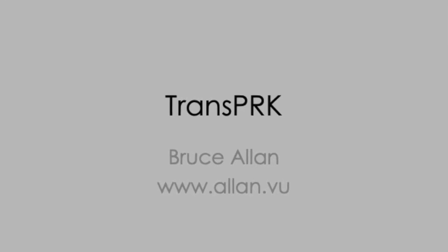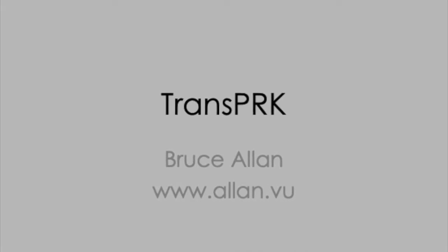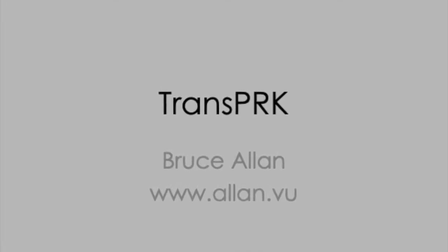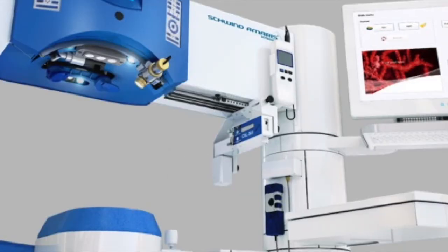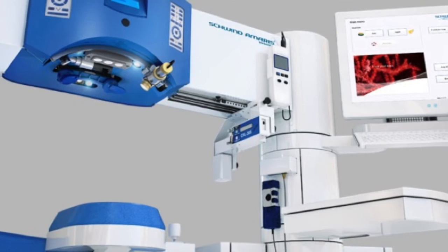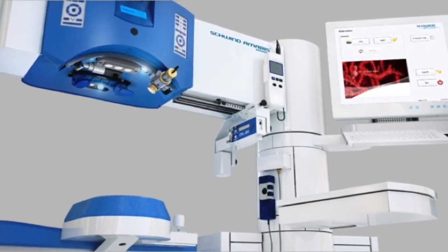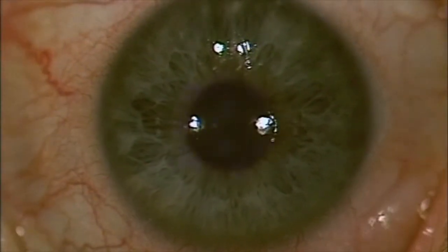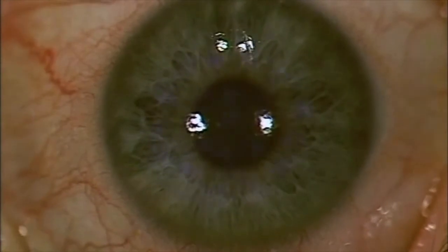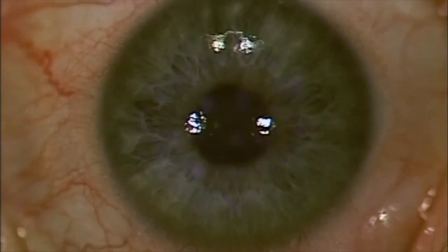Here we're going to share a few tips on transepithelial photorefractive keratectomy, more commonly known as TransPRK or Smart Surface. This is one of the very nice capabilities of the Schwind Amaris 1050RS excimer laser system that we've got at Moorfields. Based on rapid ablation, excellent tracking and the fact that the epithelium ablates at approximately the same rate as the stroma, it's a simple procedure to perform but there are a few tips that will help you to get good results consistently.